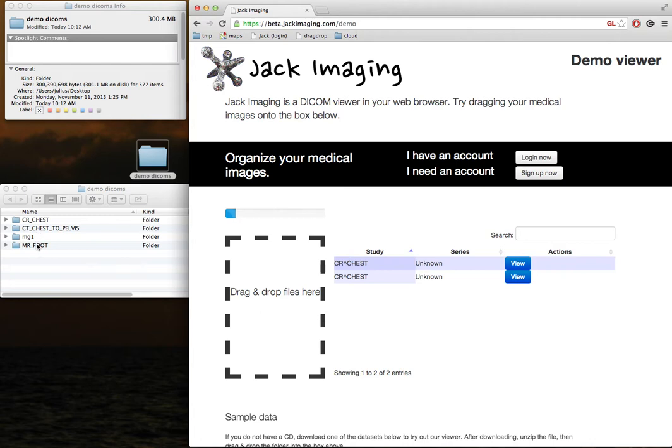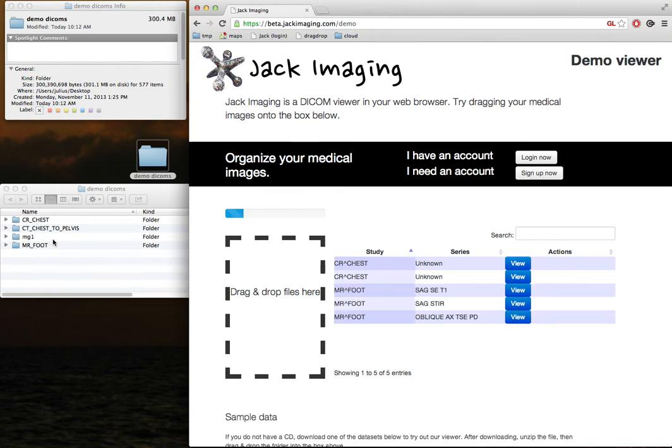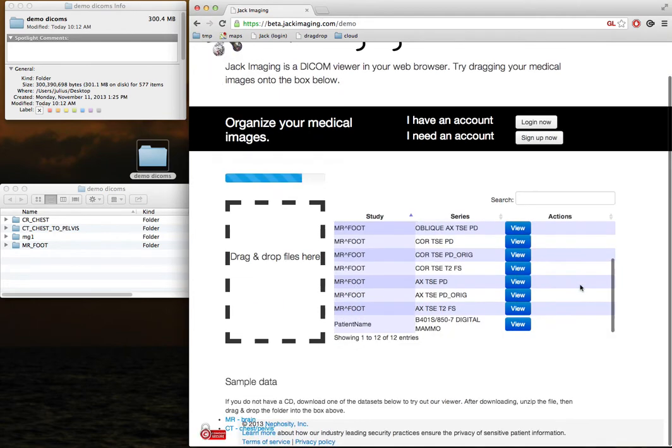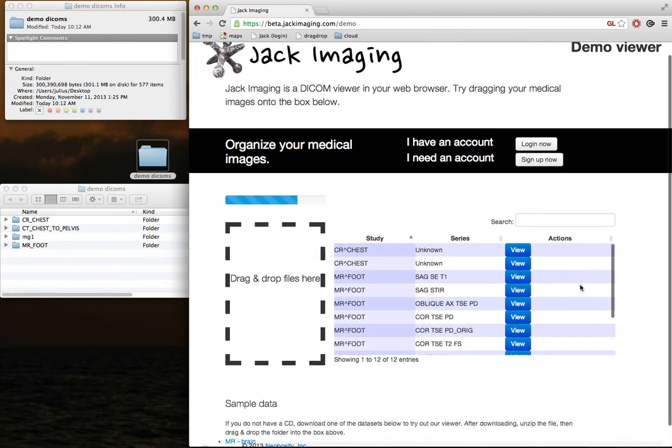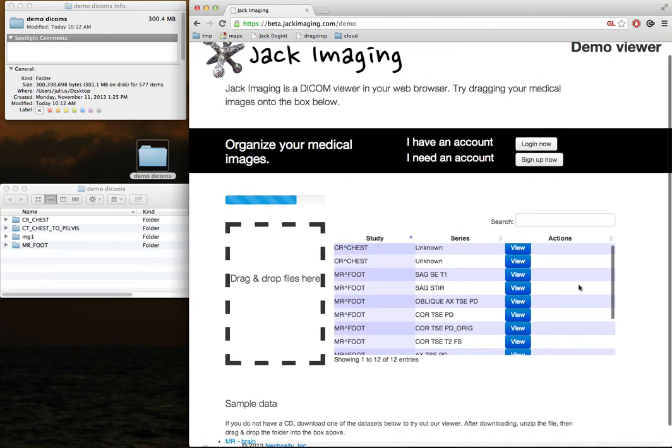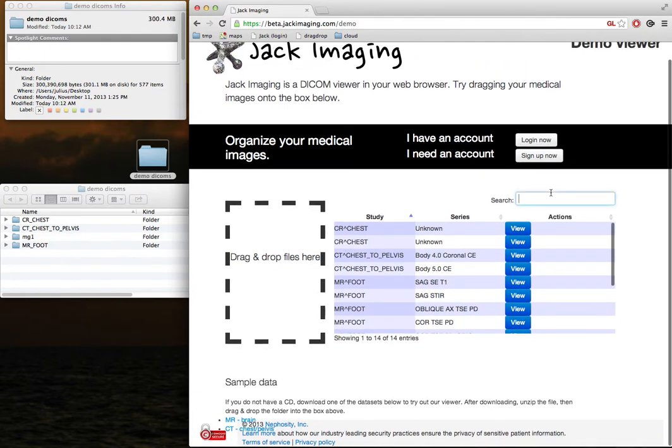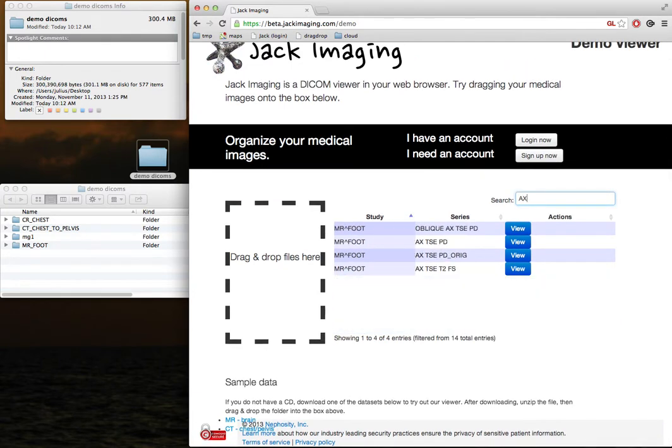Over here, you can see that there are four studies, each of which contain multiple series. We will gradually populate the table with entries. You can scroll up and down in the table, and you can look for series by name.